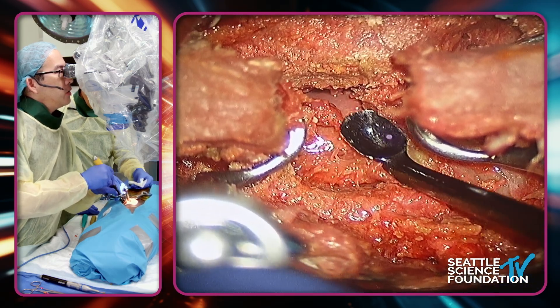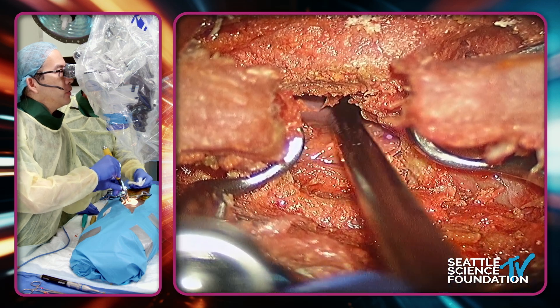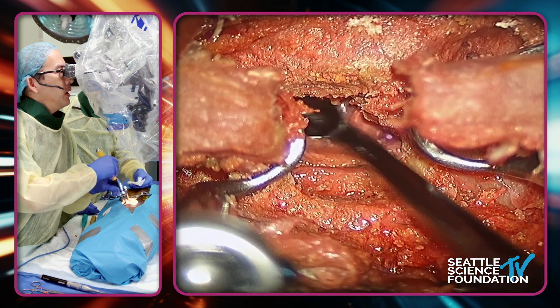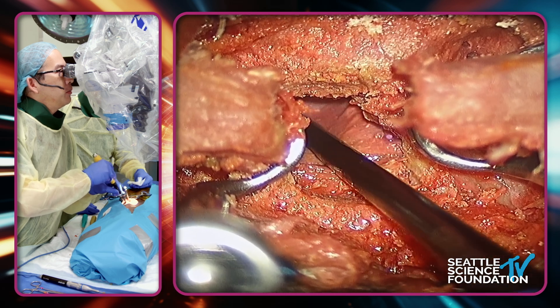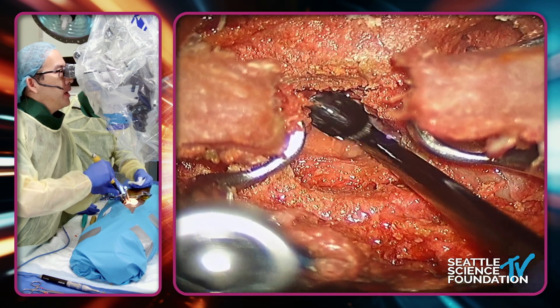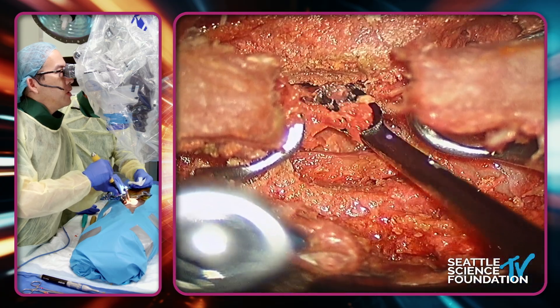Here is another critical move. For instance if this were L4-5, you would see a patient with a little bit of dorsiflexion weakness. We're very comfortable that L5 is good, but as you palpate L4, I use this angled curette — which I think is a critical tool — to come up right to the foramen. You can feel and watch the thecal sac; you don't want to abuse it. Going into the foramen where L4 is exiting, I can palpate and get under there and then come back and reduce all of this ligament for the rostral nerve root. I think that's another reason why CoFlex fails — because we're not doing this maneuver.